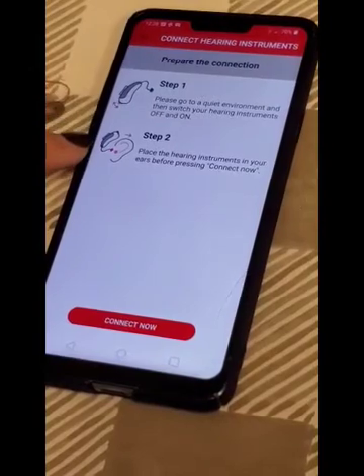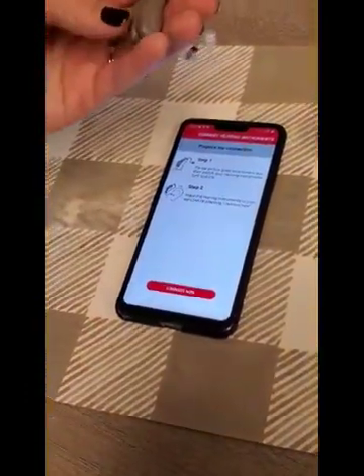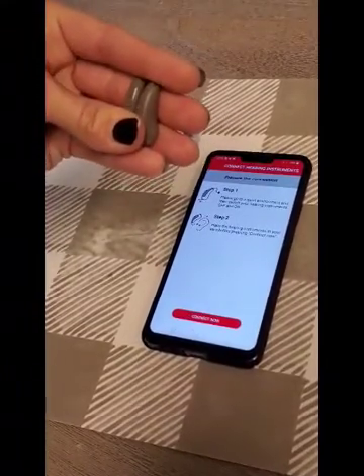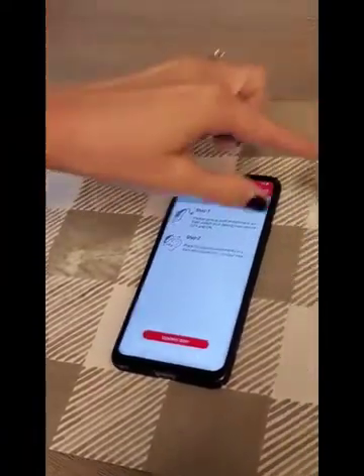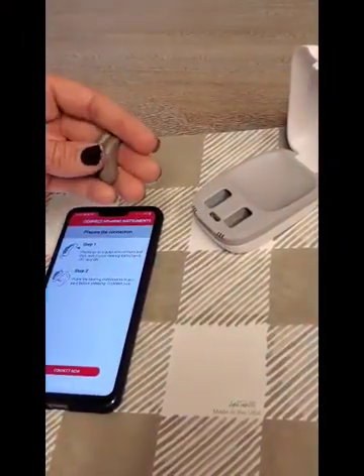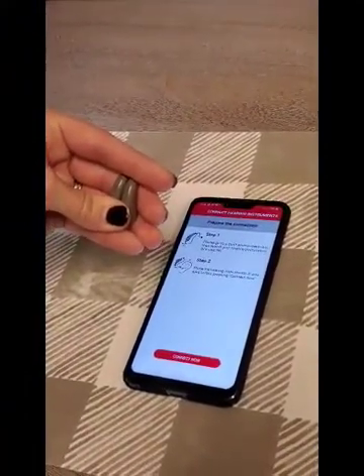What we're going to do first is restart the hearing aids. There are two different ways to do this. You can take the bottom button on the hearing aids and press and hold both bottom buttons for about five seconds to turn them off. Or you can place them in your charger, where they'll automatically turn off and restart as soon as you take them out. I'm going to press and hold this button here for about five seconds and it will reboot the hearing aids.